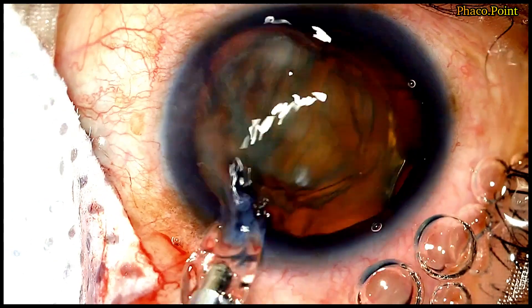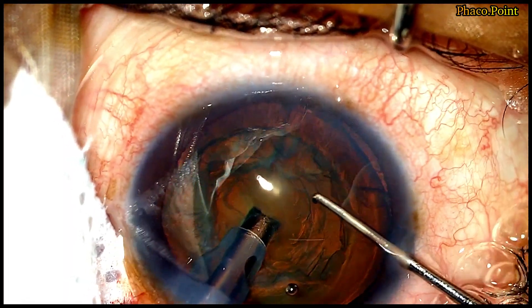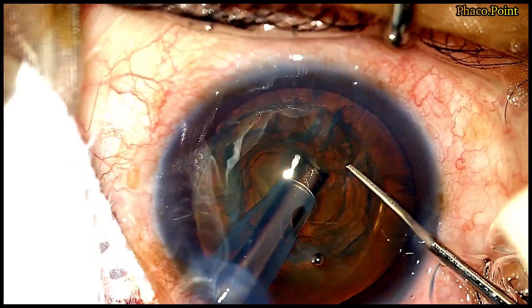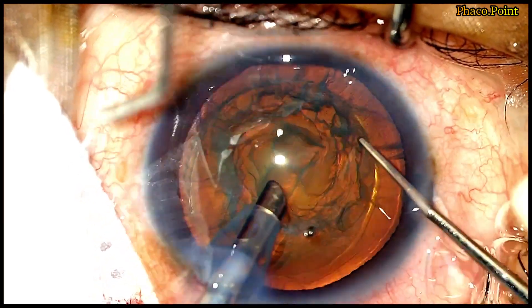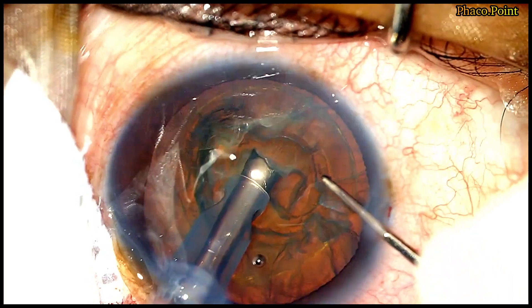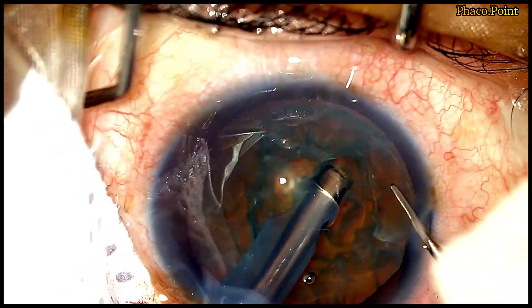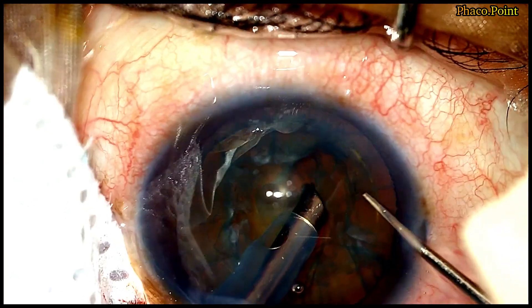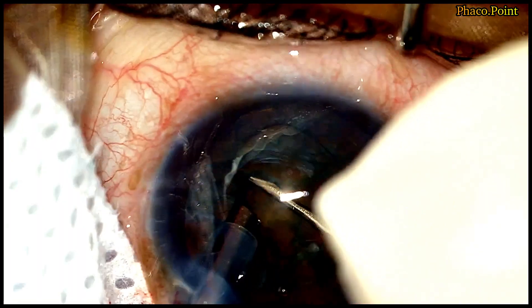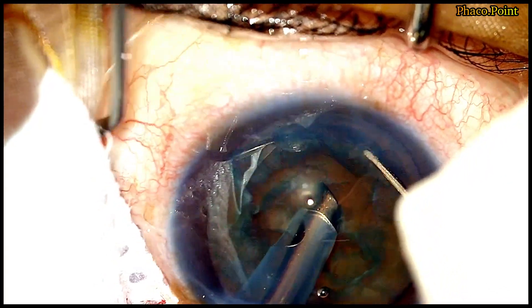Soft cataracts come with their own inherent challenges. The softness of the cataract makes it quite difficult to actually bury and impale the nucleus, let alone get a good hold of it, therefore further increasing the challenge in breaking down this nucleus. The tendency to cheese wire through the nucleus as we attempt to divide it poses further problems. It is for these reasons I've often considered that the nucleus management of soft cataracts is probably more challenging than dealing with harder cataracts.